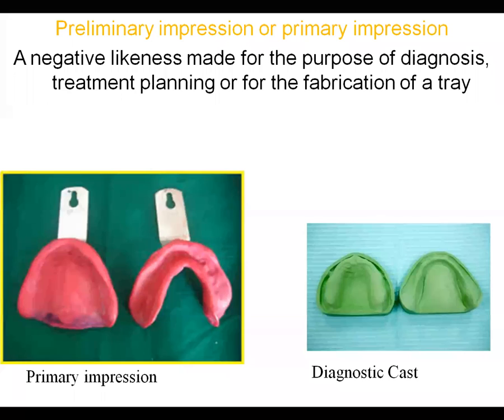Always use the word make an impression. We don't take the impression, we make the impression as far as our tissue structures, the foundation area, are present.